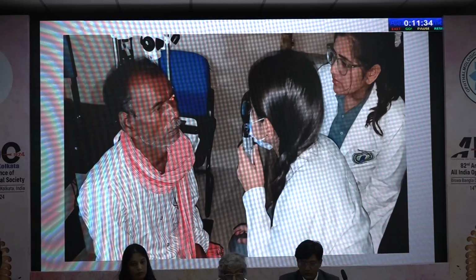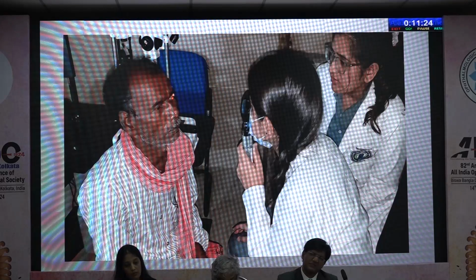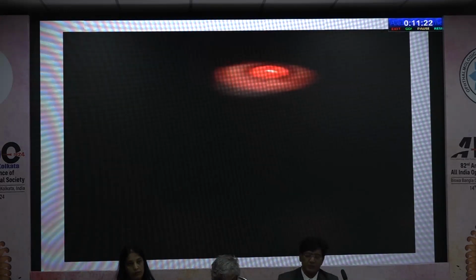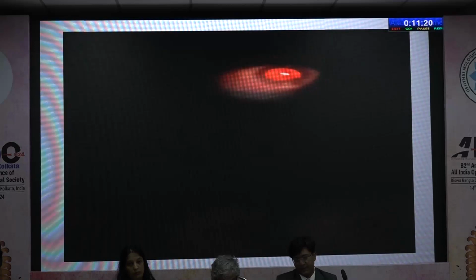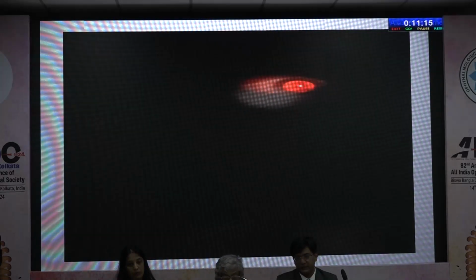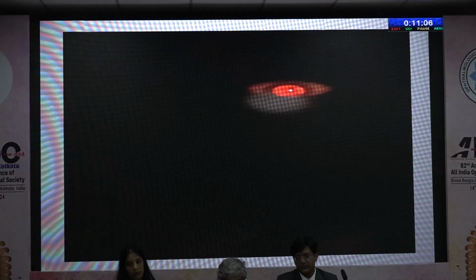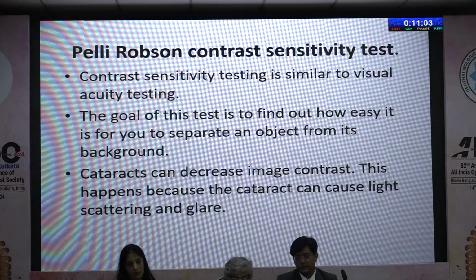We will follow the RRR and LLL rule. If we are observing the patient's right eye, we have to observe through our right eye and hold the ophthalmoscope in our right hand. The same applies for the left eye. In this video, we are seeing a shadow against the red fundal glow. This shadow is strongly suggestive of an opacity, which may be cataractous or due to other things like vitreous hemorrhage, corneal opacity, etc.